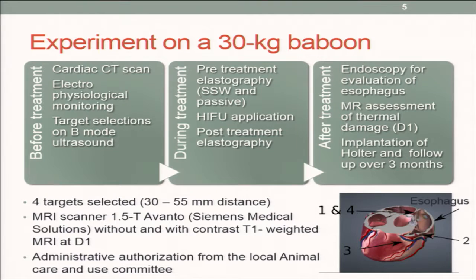We confirmed the heart was visible acoustically. We followed the electrical physiology of the heart before treatment, and used B-mode imaging in order to select the target on the heart.